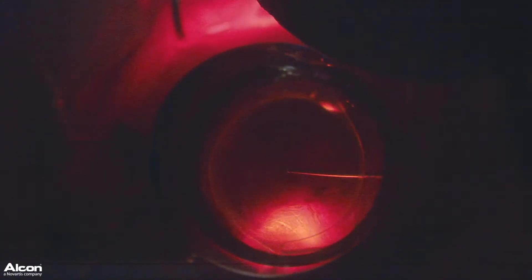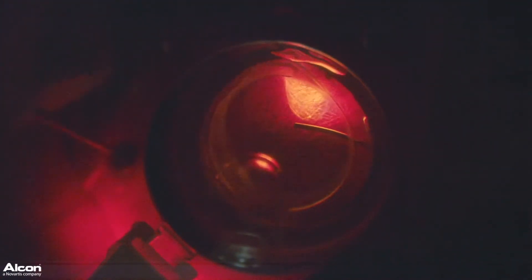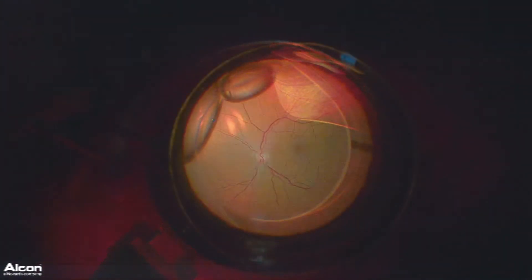And this gives me just enough illumination to highlight the vitreous, to see what I'm doing, and to be able to do a complete and comprehensive pars plana vitrectomy. This may be advantageous going forward, because it gives us a chance to make fewer incisions in the eye.